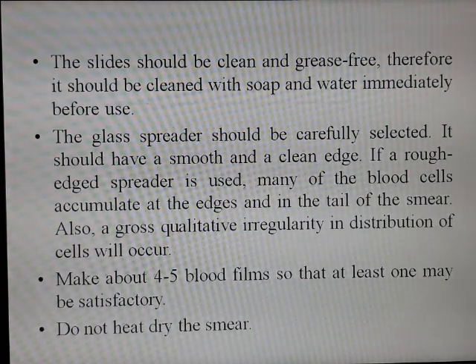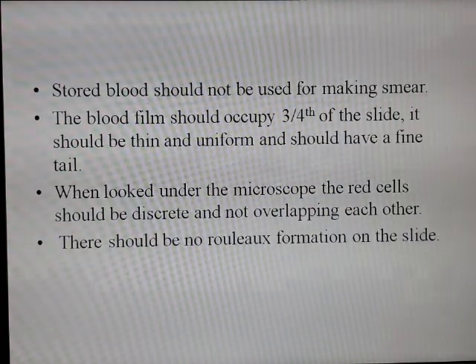We will make about 4 to 5 blood films so that at least one may be satisfactory, and we will not heat dry the smear. Stored blood should not be used for making the smear. The blood film should occupy 3/4 of the slide. It should be thin and uniform and should have a fine tail.